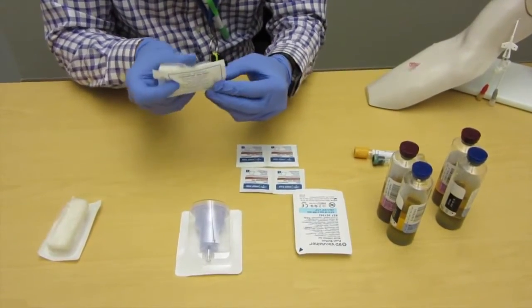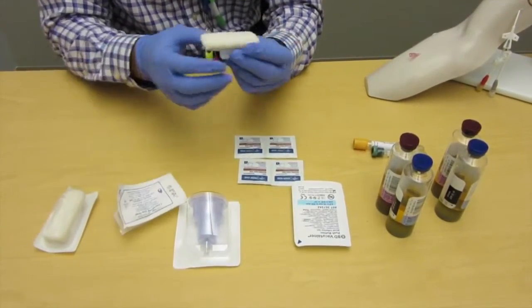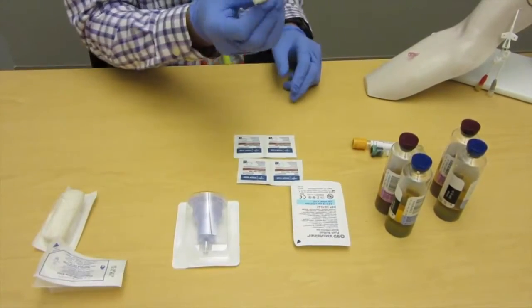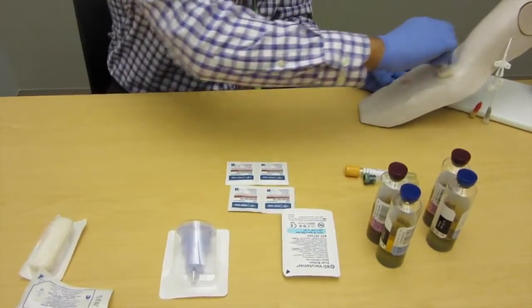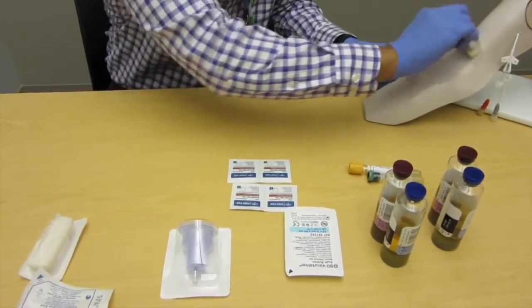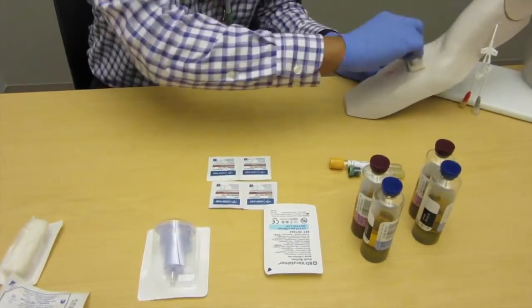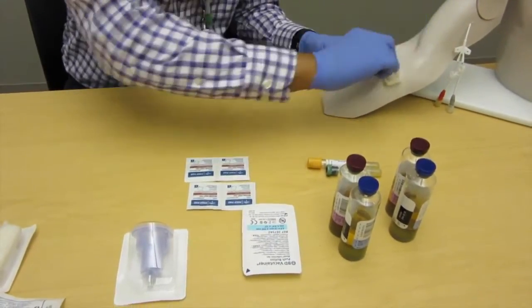Let me show you some improper technique because you want to make sure you avoid these things. How long are we supposed to scrub for? We're supposed to scrub for 30 seconds.